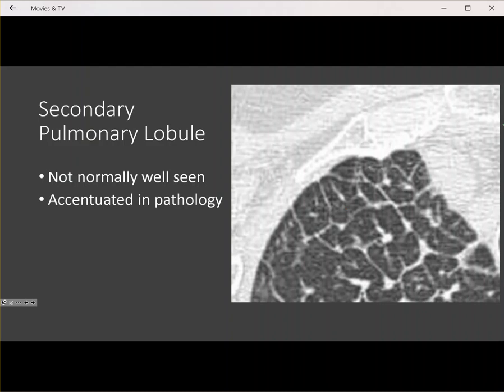So what do we expect to see on CT? Normally on CT, we're not going to see the secondary pulmonary lobule well — these structures are not well seen. The exception is the pulmonary artery in the center, which we may see. Usually the outline of the secondary pulmonary lobule is not seen unless there's pathology present. In this case, we have somebody with smooth interlobular septal thickening, which is actually outlining the secondary pulmonary lobule — you can see a clearly defined one here, as well as some additional ones out in the lung periphery.